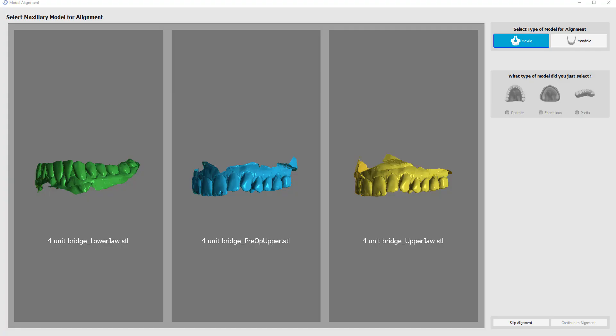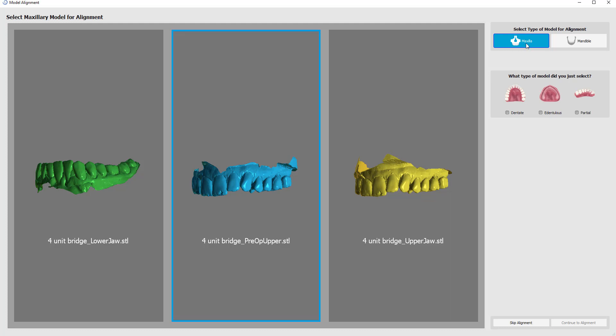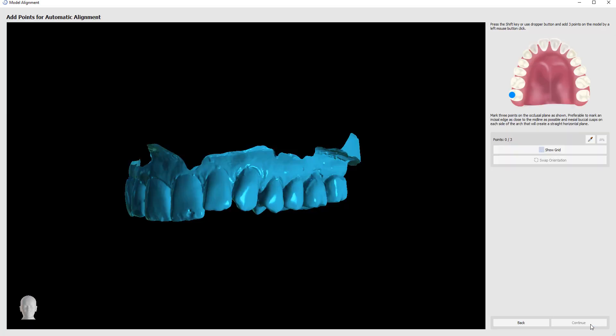The software automatically opens the model alignment screen and prompts us to select the model that represents the maxillary. So we're going to left-click, select the model, confirm maxilla and the relevant model type, dentate, and click continue to alignment.